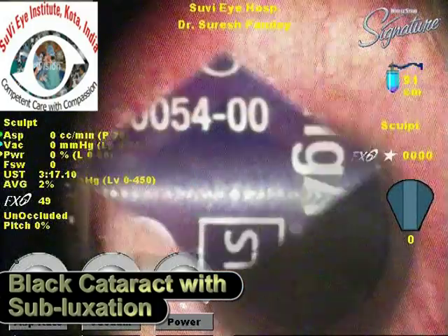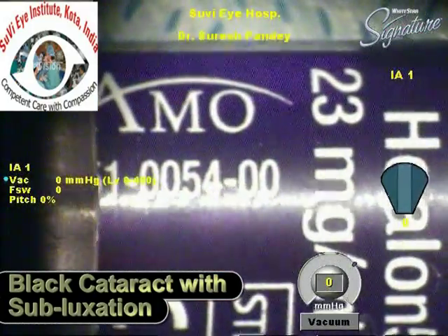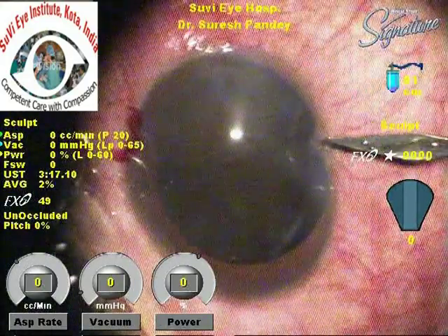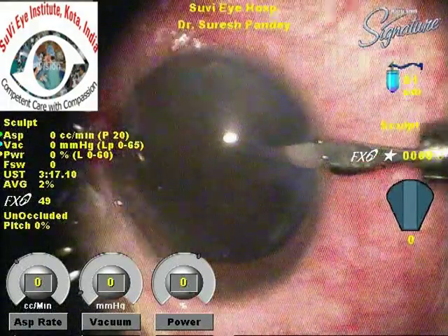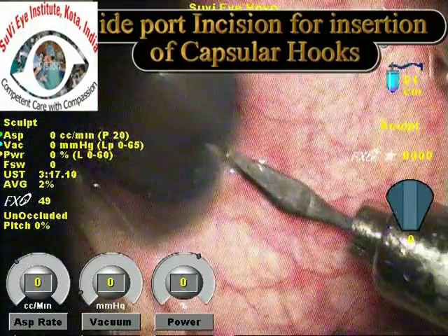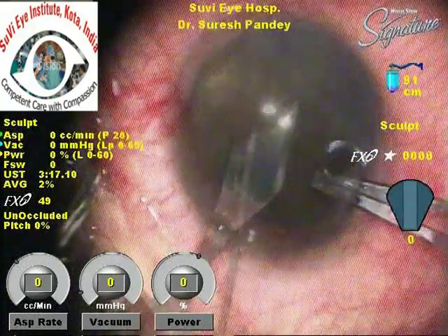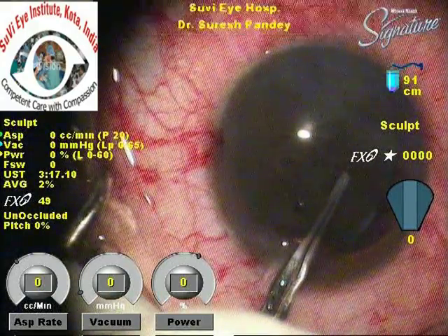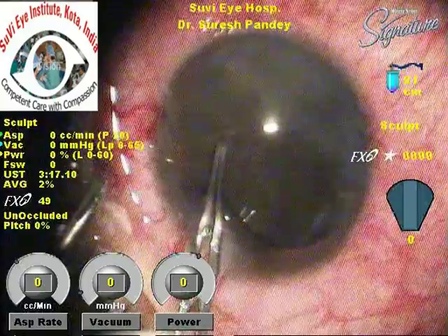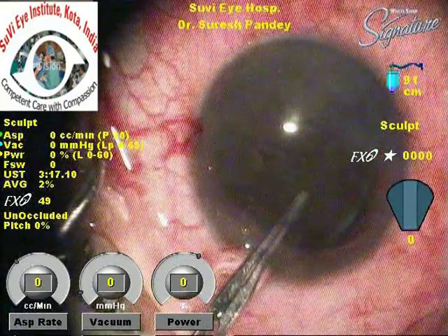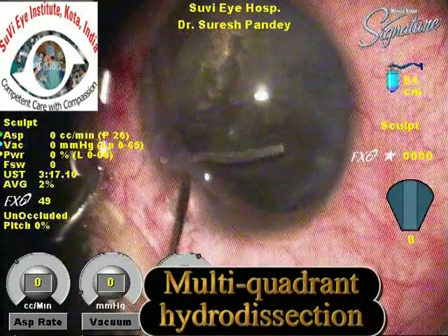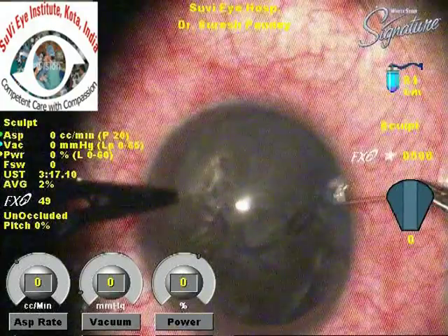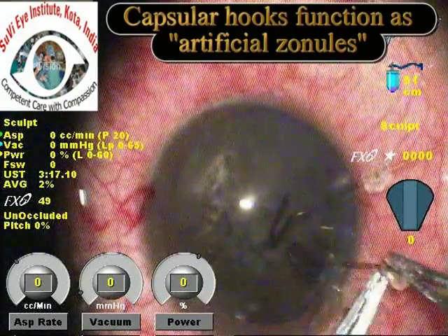In this second case there is a black cataract with subluxation. The first step is to inject ophthalmic viscoelastic to plug the vitreous and prevent prolapse into the anterior chamber. Side port incisions are made to place the capsular hooks. The capsulorrhexis is initiated away from the area of the dehiscence and performed gently, as counter-traction on the capsule is quite low in these cases.